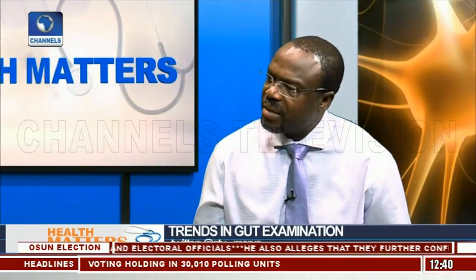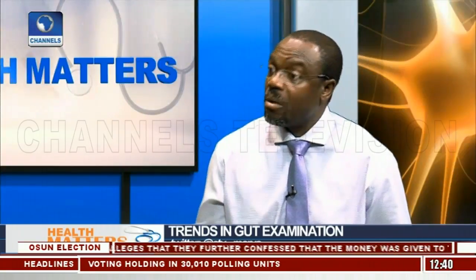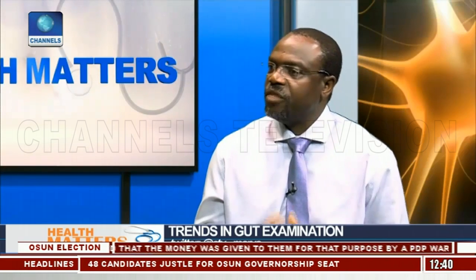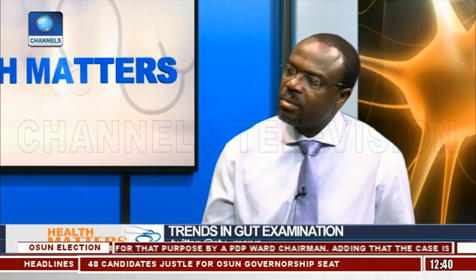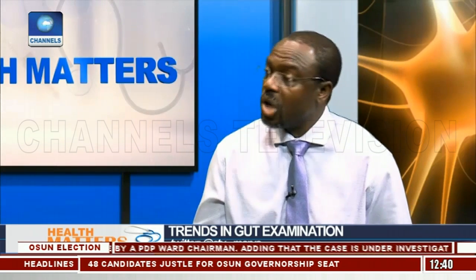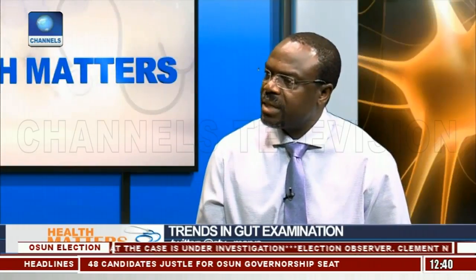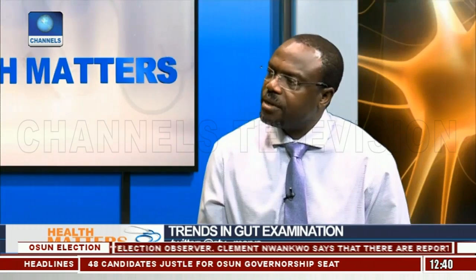So that is one of the benefits of endoscopy when you find polyps. Now, I must say that not all polyps can be removed, so you have to visualize the characteristic of the polyps and decide whether it's amenable to endoscopic removal or not. If it is, then you just put in your accessories to facilitate that. So it can be a one-stop shop for that purpose.